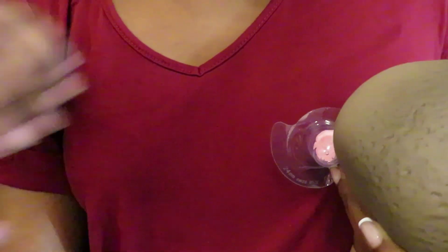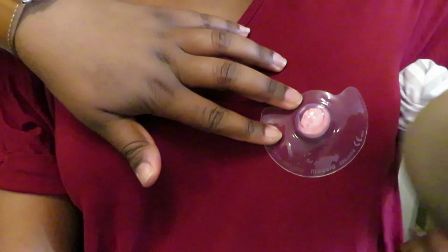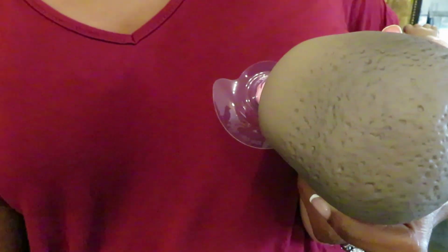So that's using the nipple shield. Here, let me just get up close for you guys. You want to get that baby latched all the way to the dark part, so that the baby can have a successful latch. And these are just troubleshooting. They're not permanent things that you're going to use. They're temporary until possibly you get home and things get a little bit easier.